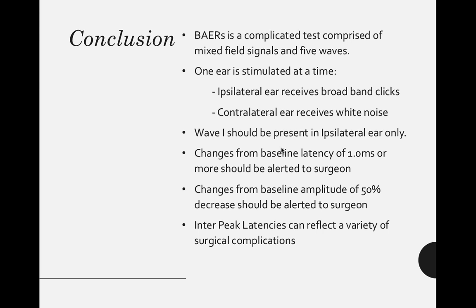Changes from baseline latency of 1 millisecond or more need to be alerted to the surgeon. Changes from baseline amplitude of 50% decrease should be alerted to the surgeon. And the interpeak latencies, the change in time between waves 1 and 3, between waves 3 and 5, and between 1 and 5, can reflect a variety of surgical complications.